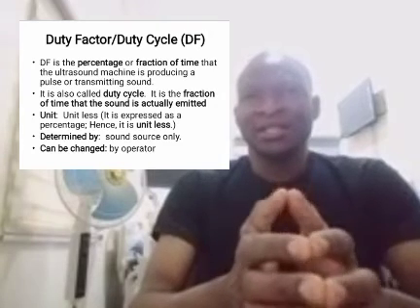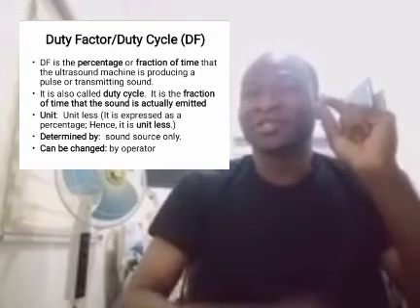Now, duty factor. I said we're going to come back to duty factor. This is the percentage or the fraction of time that your ultrasound machine is producing a pulse or transmitting sound. It's also called duty cycle, and it is the fraction of time that sound is actually emitted.